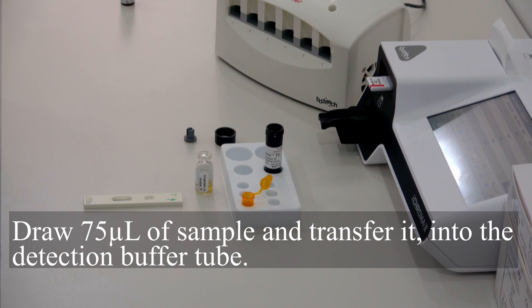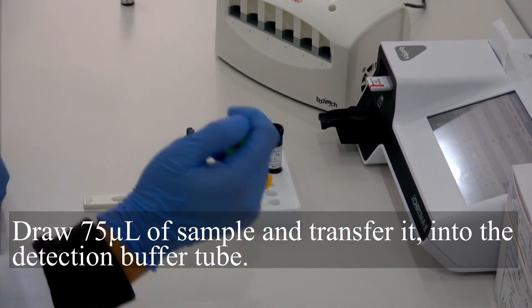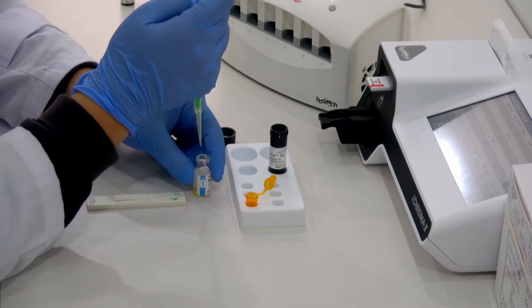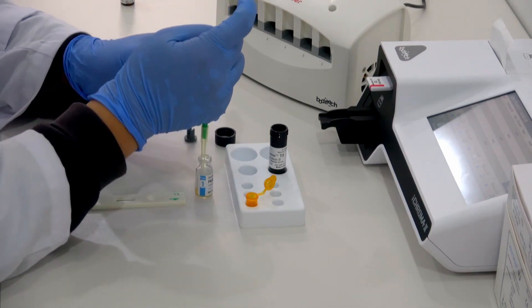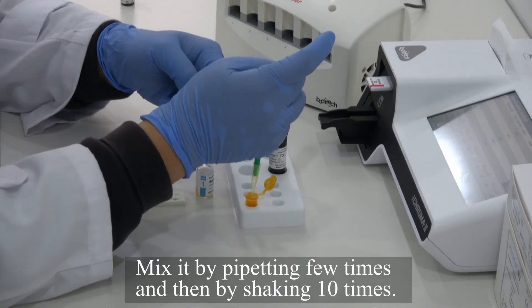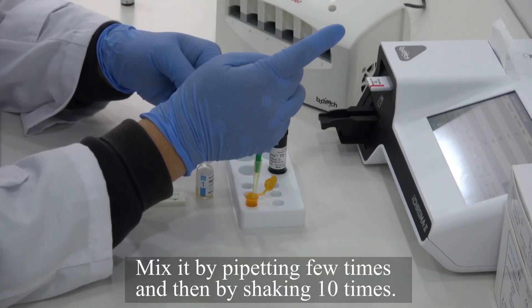Draw 75 µL of sample and transfer it into the detection buffer tube. Mix it by pipetting a few times and then by shaking 10 times.